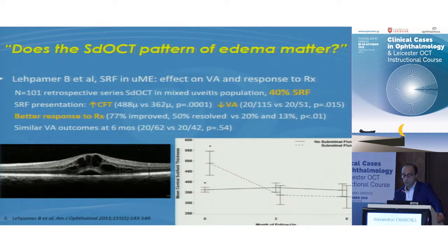It depends, of course, on the population on the study. Now, all these patients that did have subretinal fluid to begin with, they had lower vision to begin with, and they had higher macular thickness. And what did they do under treatment? Well, as Marco Michelakis showed, they did good. They did well under treatment.